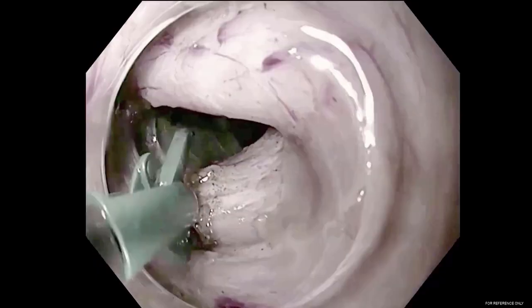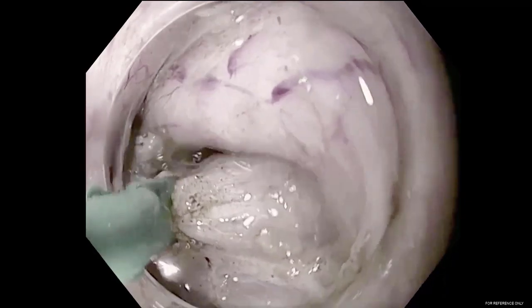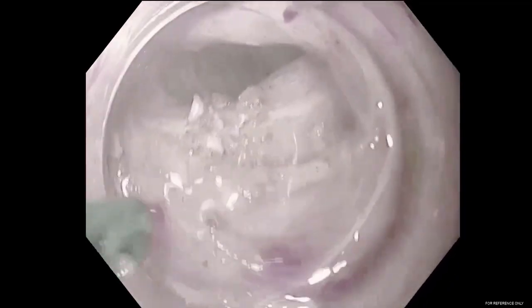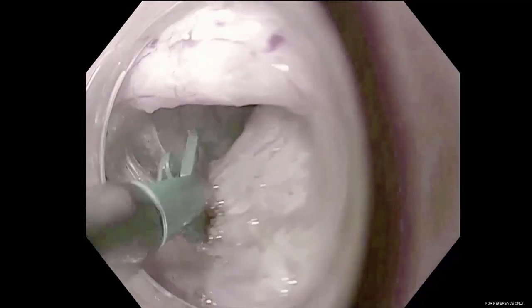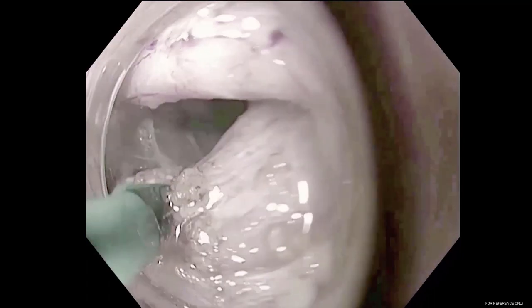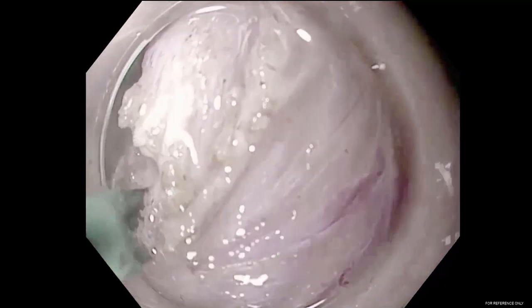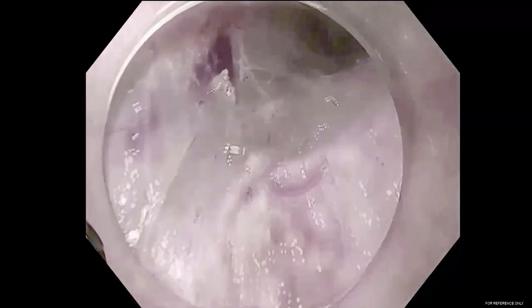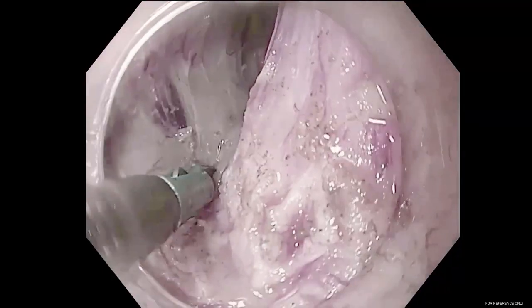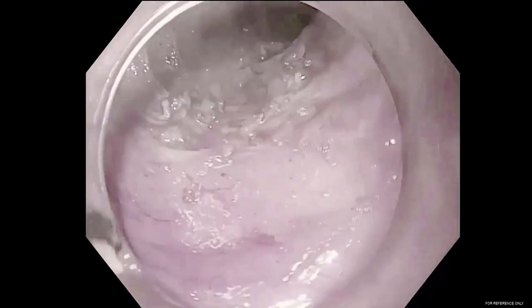We used a Junior Long SB knife, which is a rotatable device. We prefer to use a scissor-type knife when teaching fellows, as you can confirm placement and amount of tissue grasped before cutting. However, any type of knife could be used without adding extra cost to the procedure. The goal is to cut all the muscular fibers — you grab the muscular fiber and cut it. The procedure continues until dissection of all muscular fibers, as seen in the video. It is essential to make sure that no muscular fibers remain.